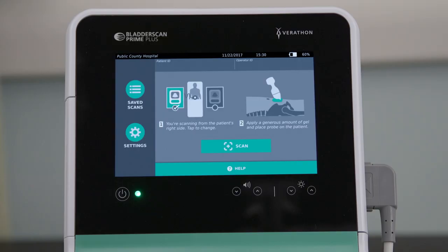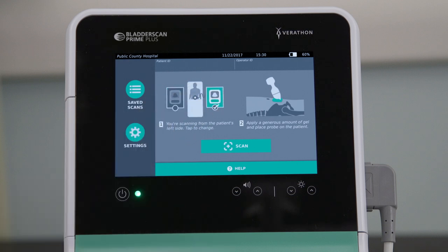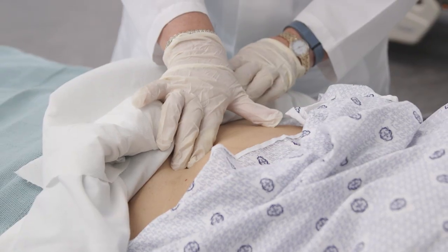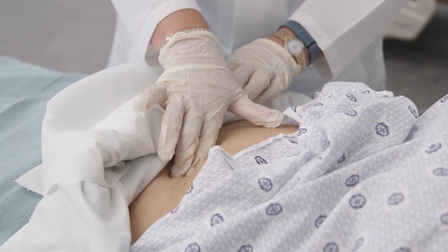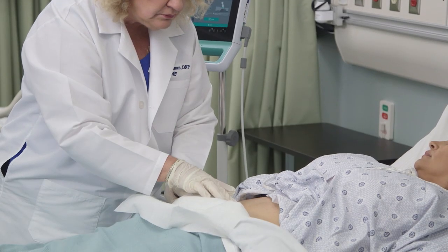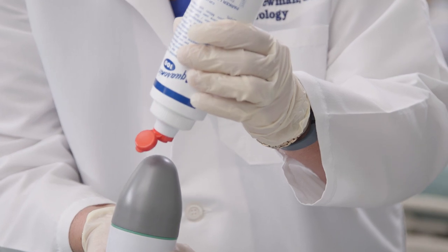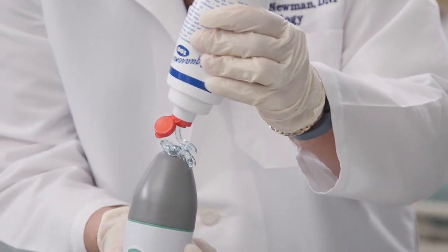Here are a few things to remember before scanning the bladder. You can perform a scan from either side of the patient. Prime Plus is preset to scan from the right side. To scan from the patient's left side, tap the icon to switch the orientation. Be sure to locate the pubic bone before placing the probe in position to scan. You will be aiming the probe toward the feet behind the pubic bone.